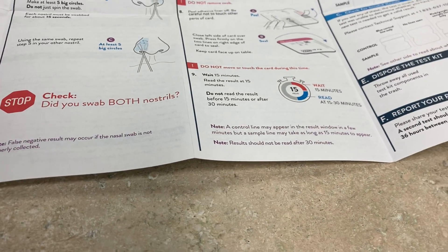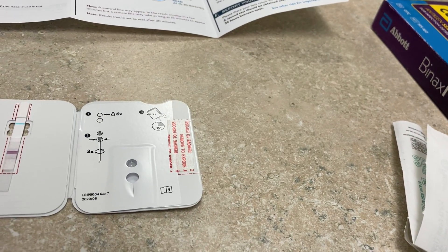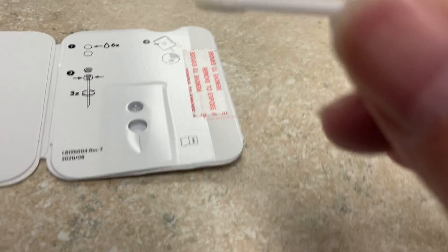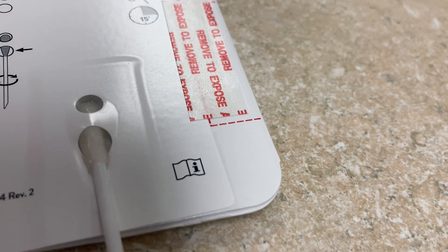Keep the card flat, then put the swab through the bottom hole, up to the top, and swirl it three times — one, two, three.